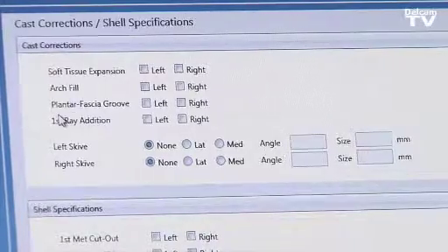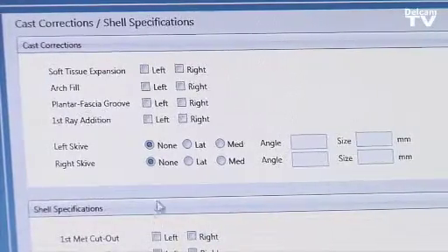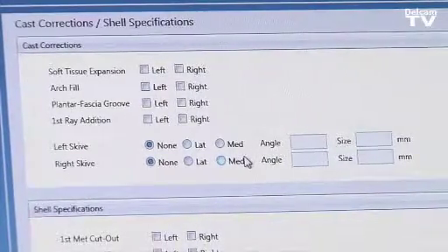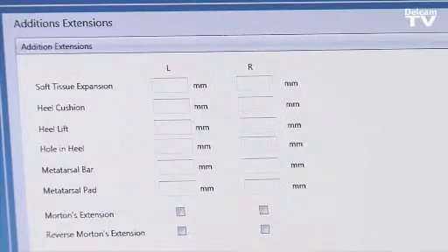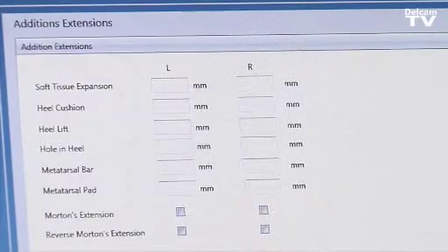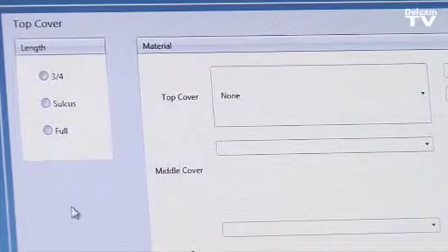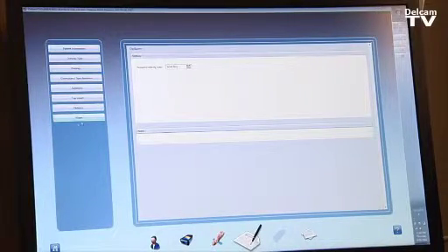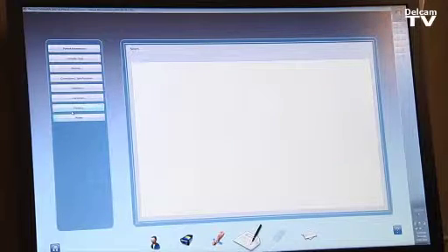For corrections, we can select an arch fill, a plantar fascial groove, or a Kirby skive — all selectable by the doctor before the scan is sent to the lab. Additions such as heel cushion or a heel spur hole can also be included, as well as the desired top cover — full or three-quarter — with material and thickness. Finally, we enter the delivery date and any additional notes.